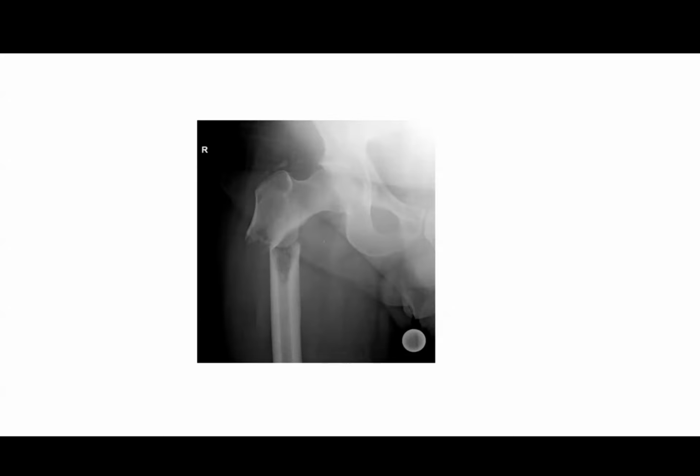I would like to have a lateral view of this hip, and this is most probably a pathological fracture. Given the thickening of the lateral wall, I would suggest that it might be a bisphosphonate-type subtrochanteric right femur fracture.